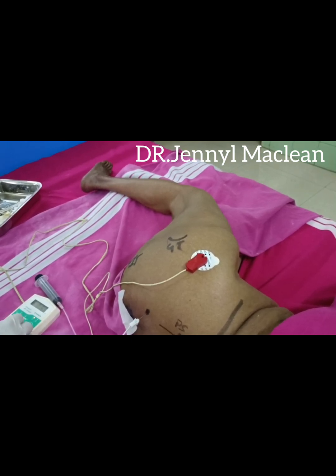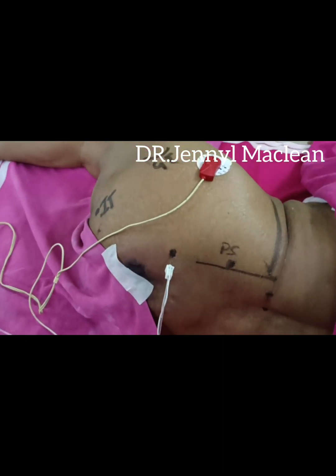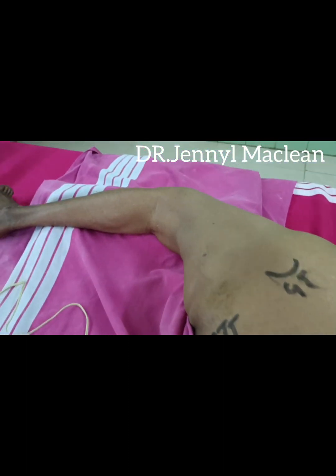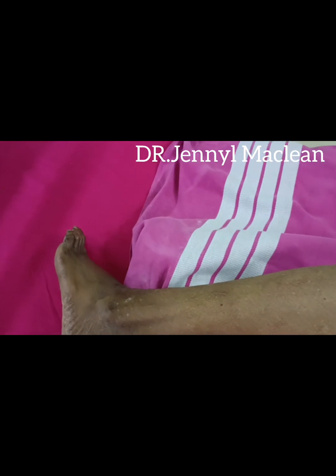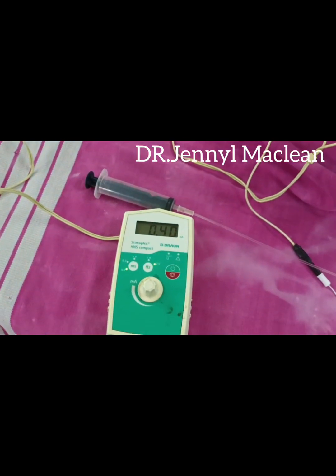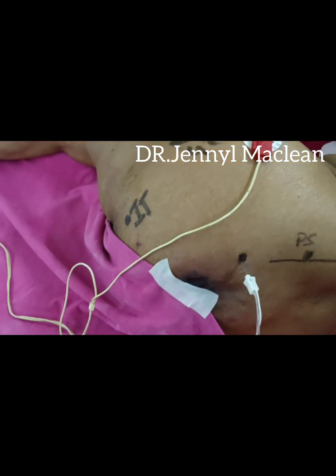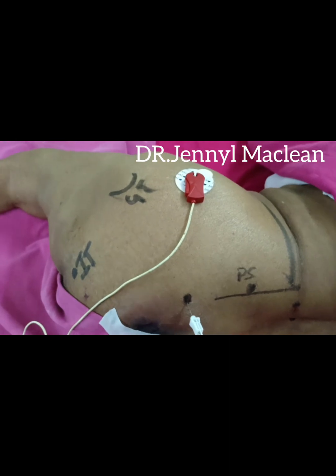Decrease your mA. Start with 1.5 or 1 mA. This is an elderly patient, so I started with 1.5. Reduce it down to 0.4 mA. If you get a good response at 0.4 mA, give the drug for a successful block. Thank you.